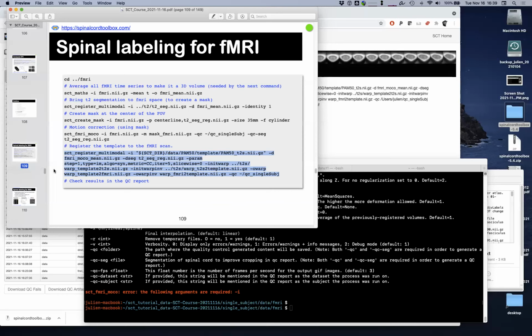So I'm not convinced that smoothing is a necessity in fMRI in general, but I know this is a controversial topic. Ken? Yeah, just to comment on that, I think it's a great discussion. And like all these steps, we don't know maybe the best answer. And of course, like you say, it depends on your analysis.